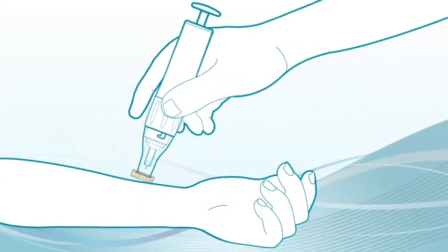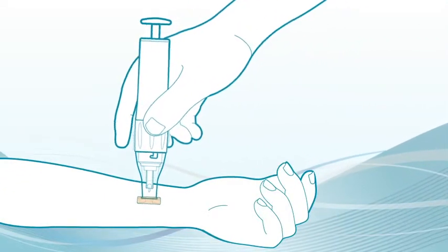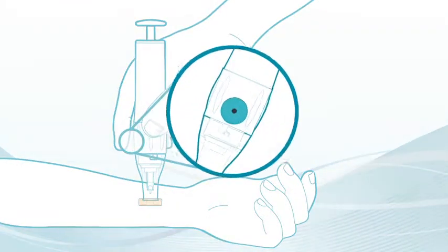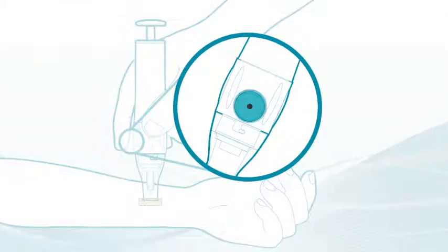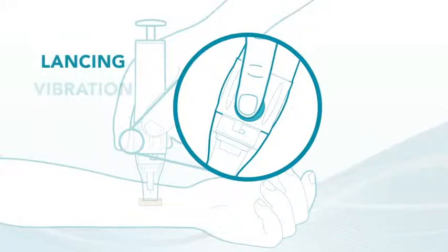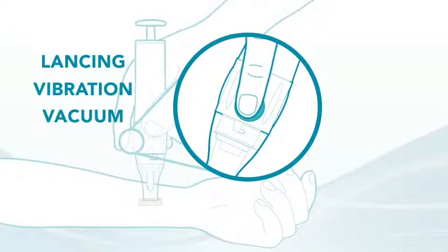Hold Gentile as if it were a fountain pen and you were going to write with it. The activation button is another of Gentile's unique features. Once the contact tip nozzle assembly is against your skin, pushing the activation button automatically starts the lancing, vibration, and vacuum simultaneously.